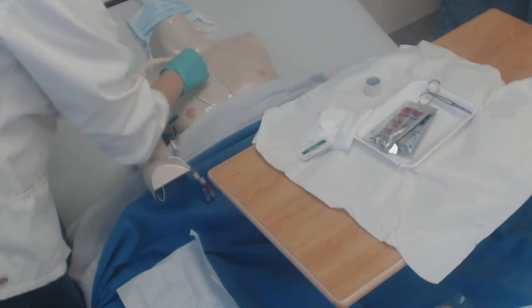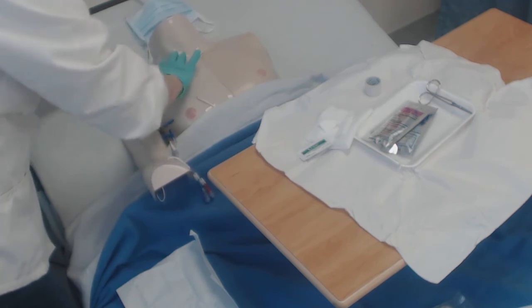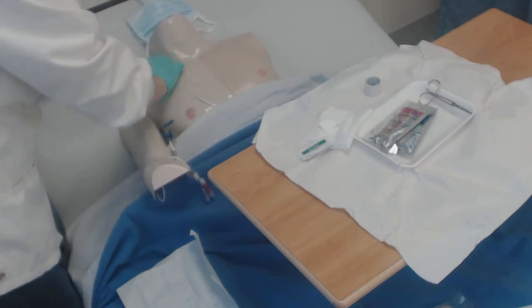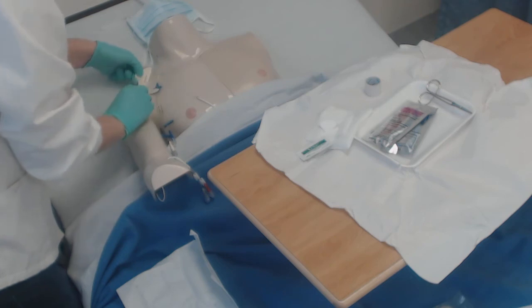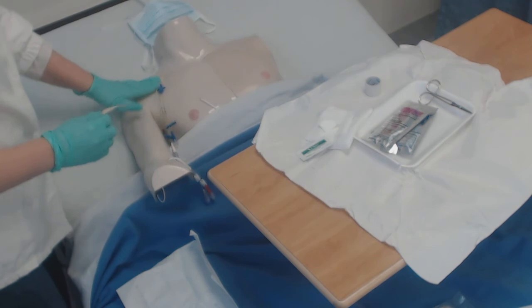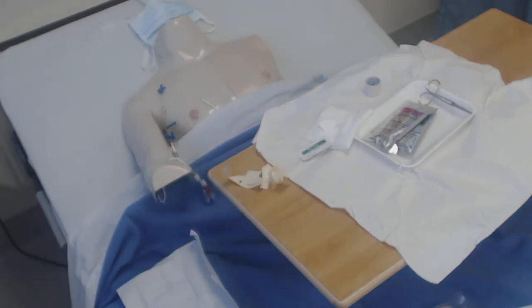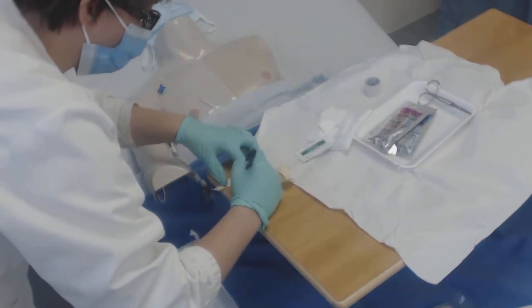Place this over the insertion site covering the blue butterfly hub and just follow it around. One thing to watch for — if the patient has longer hair, be very careful to get that out from under the Tegaderm, because the Tegaderm is sterile and their hair is not. So if they have hair they haven't washed in a week, we have a little bit of a problem.